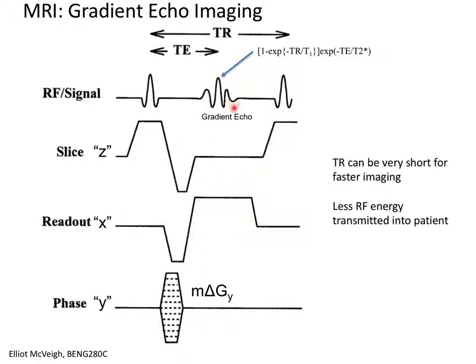We're going to read out, we're going to digitize our signal during the readout phase of our X gradient here. If we're not digitizing, we can just apply these gradients all together, because all of those phase shifts will just add up in each direction. So we apply the phase encode gradient, and we pre-phase in X such that when we read out with our X gradient on, we will already have applied a negative phase shift in the X direction.